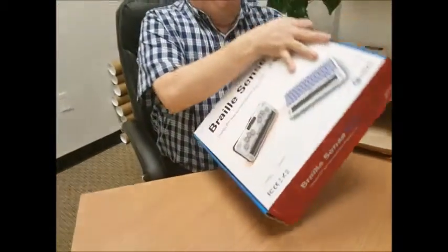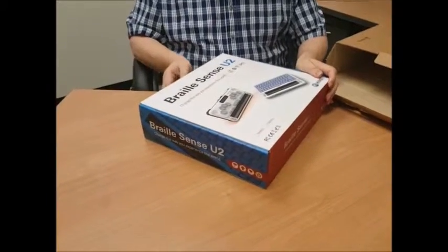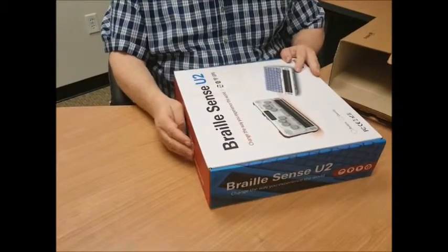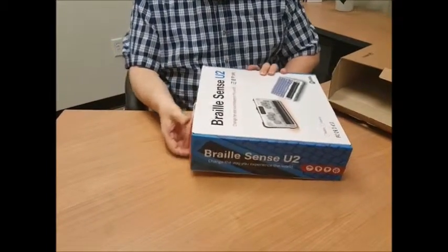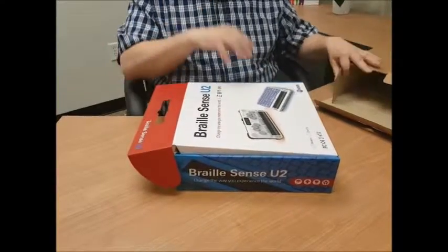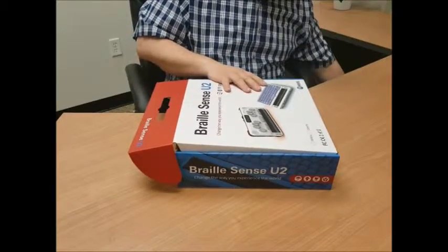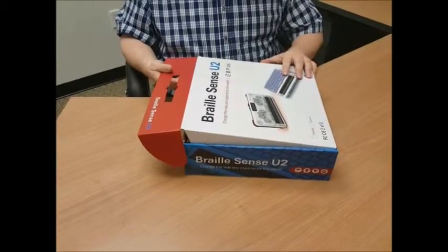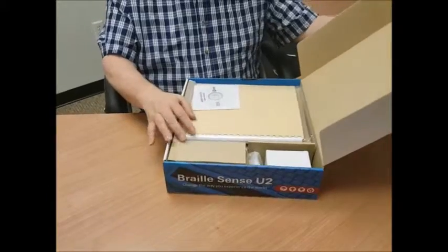We're going to flip this gift box over. The way you open this is on the front side — there's actually a plastic handle that comes out of the box that you can feel. The flap that's there flips out over that handle and then flips up. I'm going to move the outside box and put it on the floor, and then we're going to open up the U2's box. Opening the gift box down as we open it up and kind of fold it back.